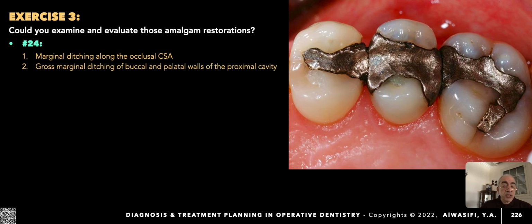Also, gross marginal ditching at the palatal walls of the proximal cavity, at the same time improper proximal contact and neglect of the occlusal embrasure. You could note also the marginal ridge is not accurate.